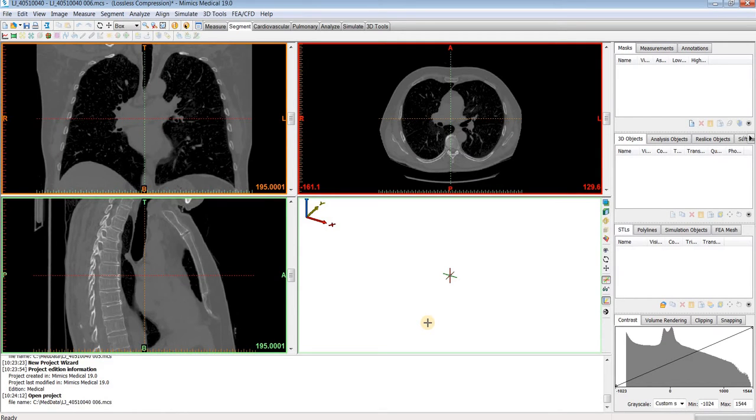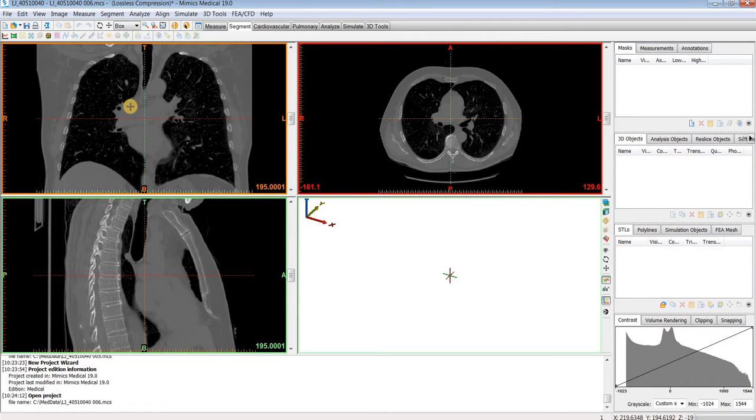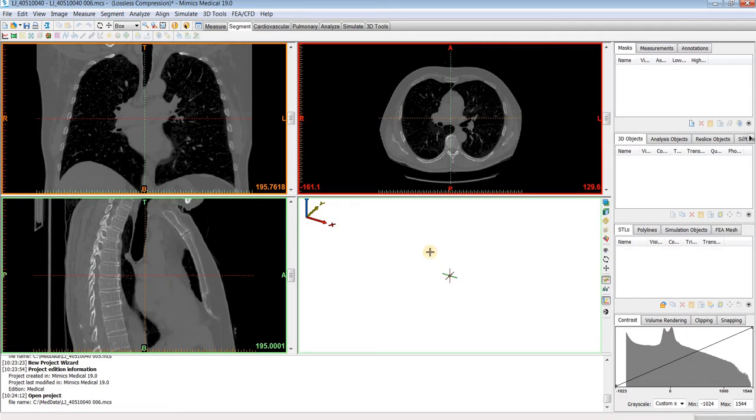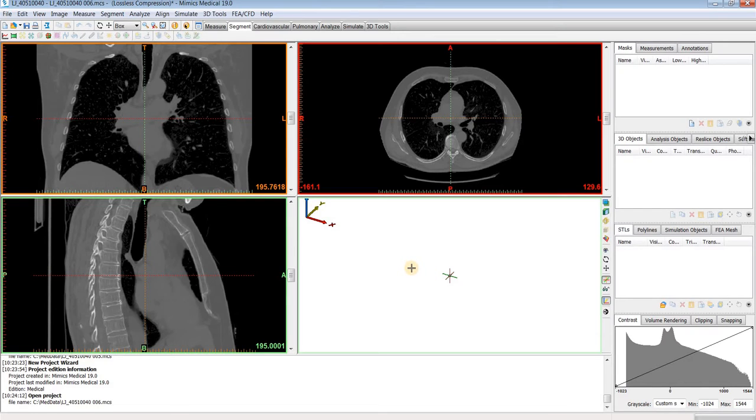You can see here we have our three planar views of the images. In the top left is our coronal plane, on the top right is our axial plane, in our bottom left is the sagittal plane, and then the bottom right is our 3D window, which any 3D models that we create will populate in there.